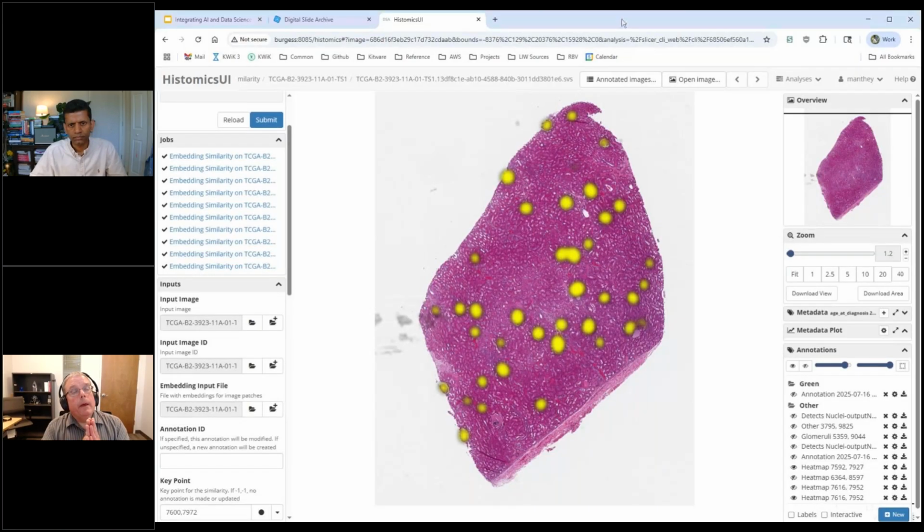So basically, DICOM's a big standard. There are image formats and there are annotation formats. Currently we have tools that aren't explicitly packaged here, but would be easy to do. In one of our other projects there's a command line tool where you can basically convert any of the images we can read to a DICOM whole slide image. The DICOM annotation formats are something we still need conversion tools for, to convert to and from DICOM annotation formats.